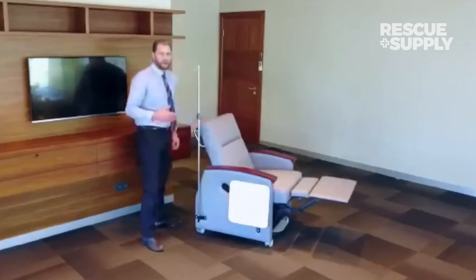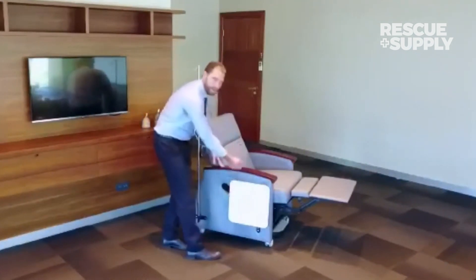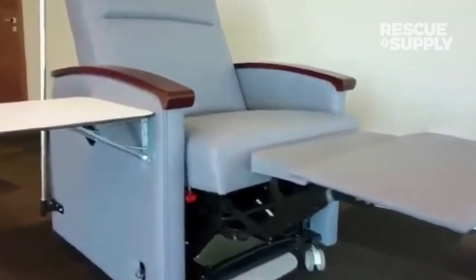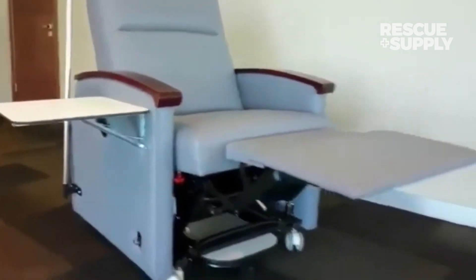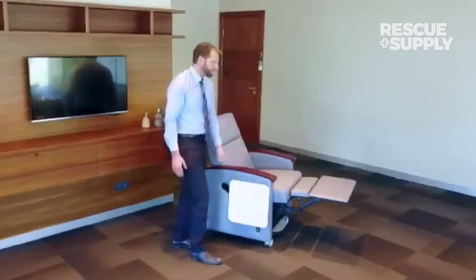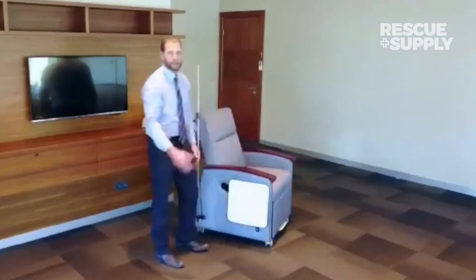If you have any other questions — for example, there's a lever that we offer on the side that allows for pushing this down. If your patients are unable to do it by their legs alone, we do offer a lever here that can both extend and retract the legs.